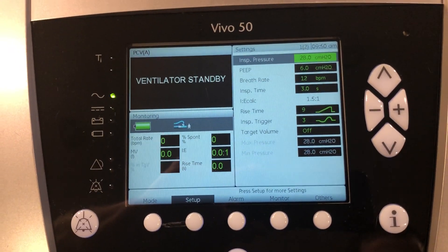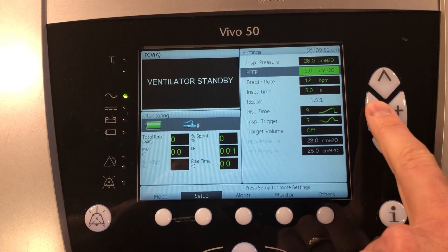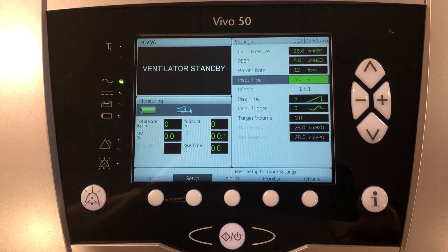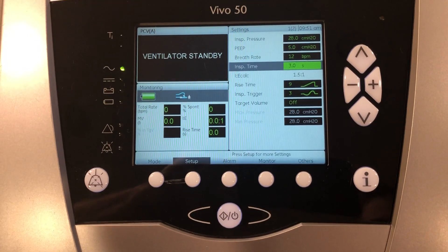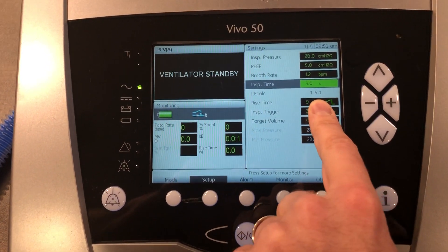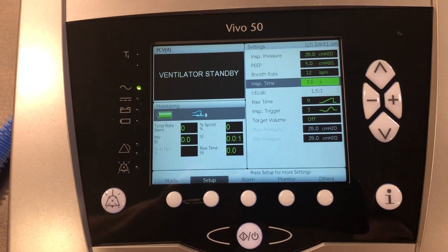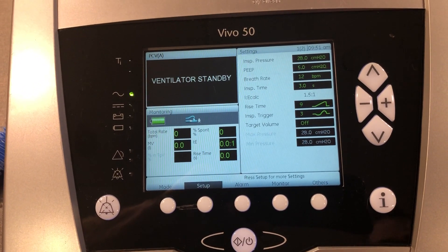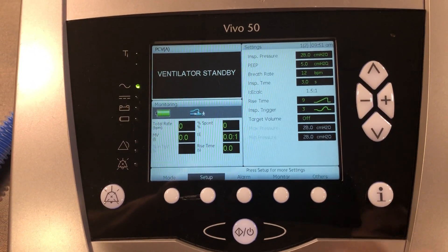We need to start with our inspiratory pressure — I'm going to start with a pressure of 28. I'm going to go down from 6 to 5 on my PEEP. I'm going to leave the rate at 12. Now here is where we need to adjust I-time in order to manipulate the ventilator so that we can do inverse ratio ventilation. You'll notice underneath I-time it's going to give us an I:E calculation. So this is at 1.5 to 1, meaning my inspiration is one and a half times longer than my exhalation. I'm going to start there, and depending on how the patient's doing we can manipulate these settings to get closer to a 2 to 1 if necessary. But I'm going to start there.